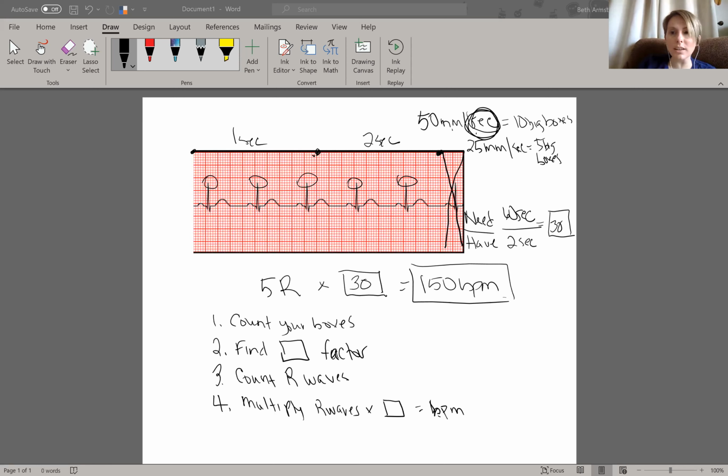You'll notice that a lot, especially in cats, which can be normal. It depends a lot on whether you're looking at VPCs and stuff like that, which are always fun, as you guys know. You still count those regardless. So it gets interesting.